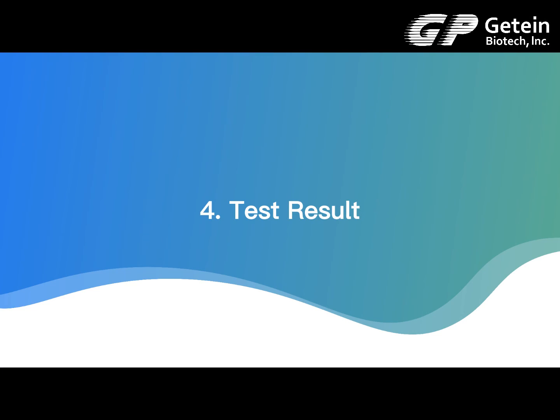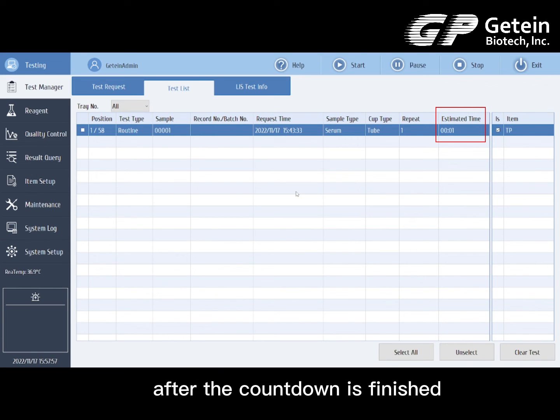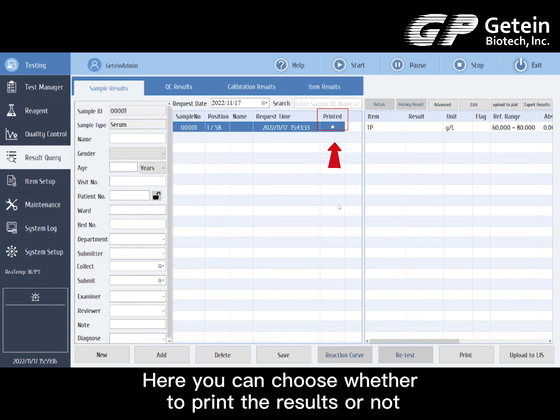Test result. The results of the test can be found in the sample results column of the result query after the countdown is finished. Here you can choose whether to print the results or not.